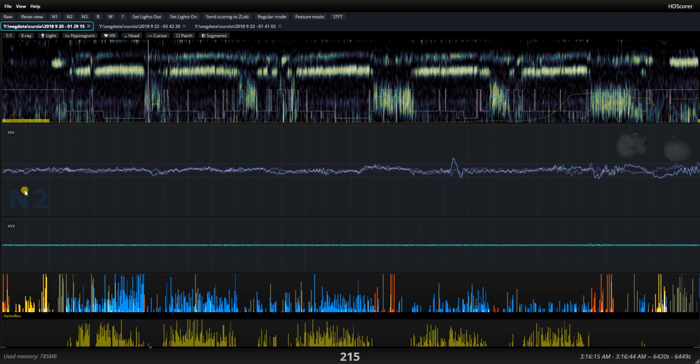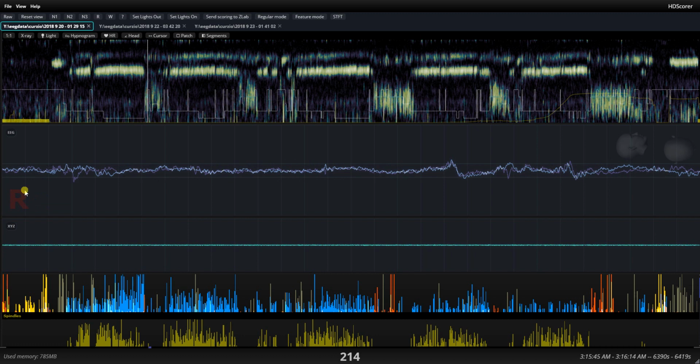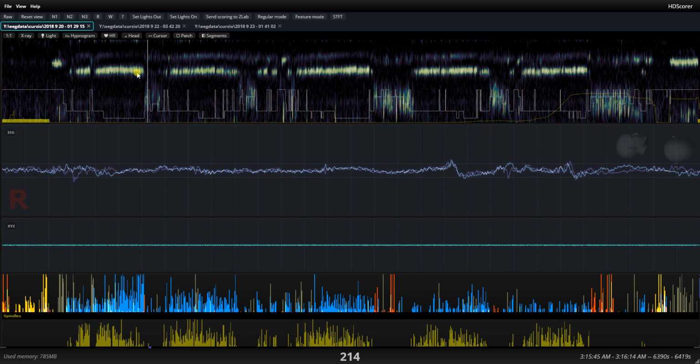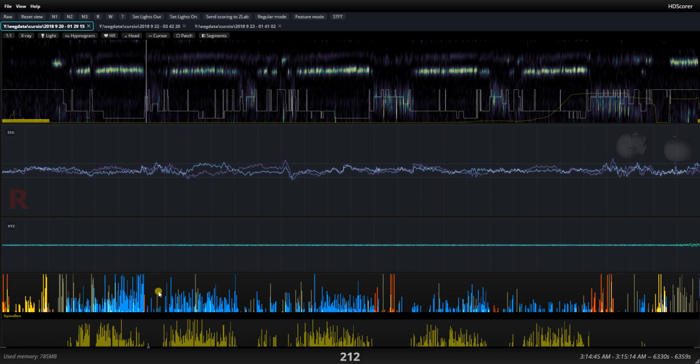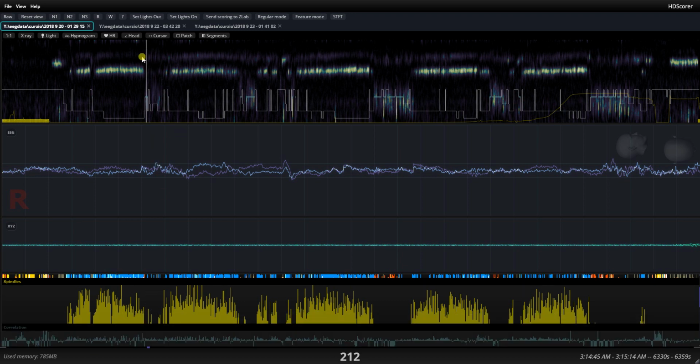I'm looking for evidence that it's REM sleep. Gonna have to turn down the brightness here. I can't see the spectrogram. I'm not even sure that this is REM sleep.